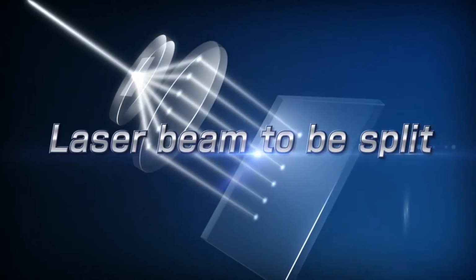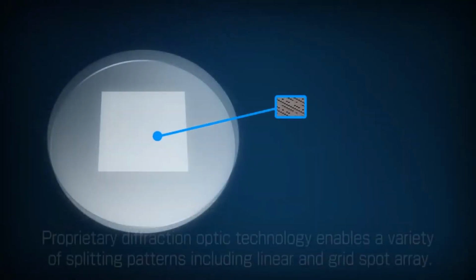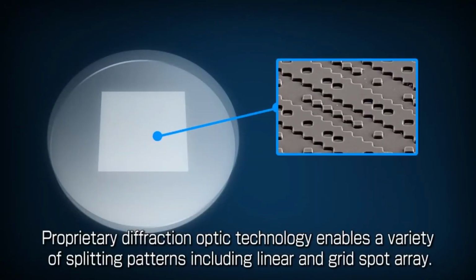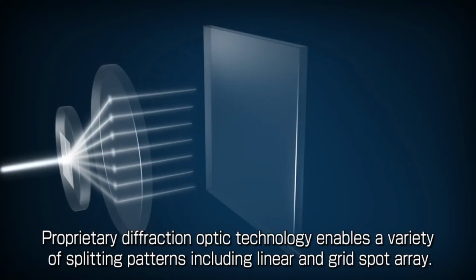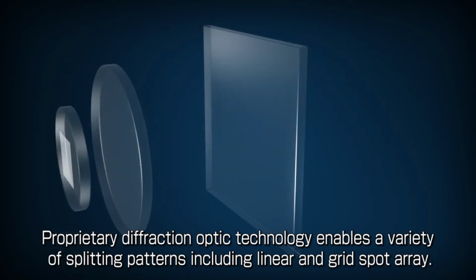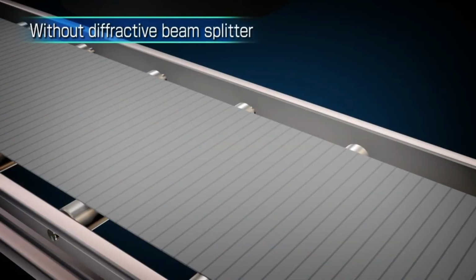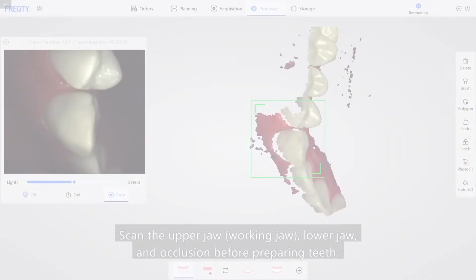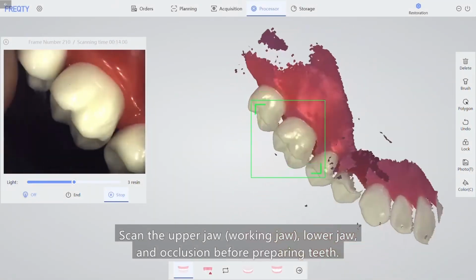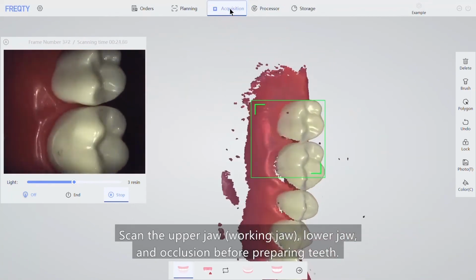Laser diffraction imaging technology divides a single beam of light into multiple beams, and then divides the light into a matrix of points or lines through a specific diffractive lens. At the same time, it can be coated with films of different colors on the diffractive lens. Then different stripe patterns can be obtained through different light sources, and the 3-dimensional point cloud of the scanned object can be reconstructed by using stripe patterns of different colors.